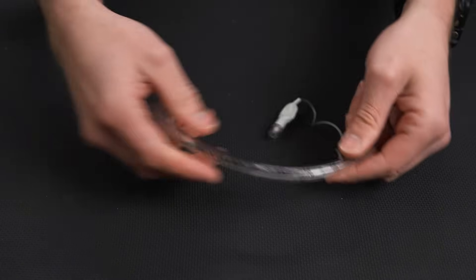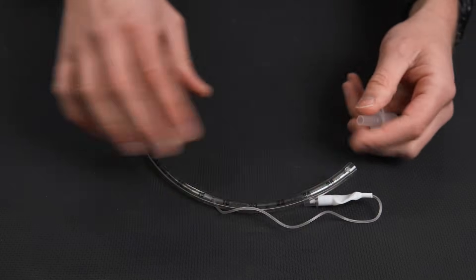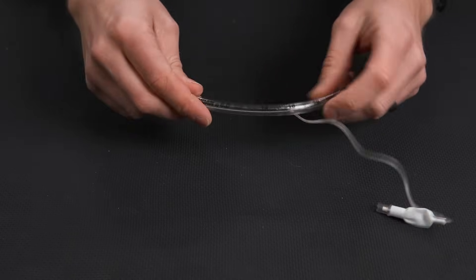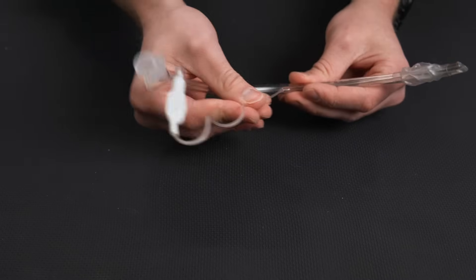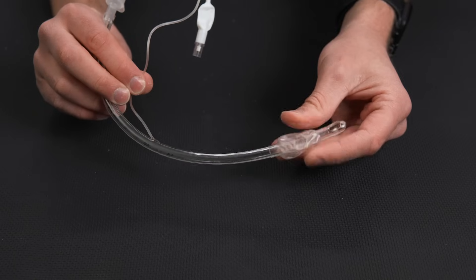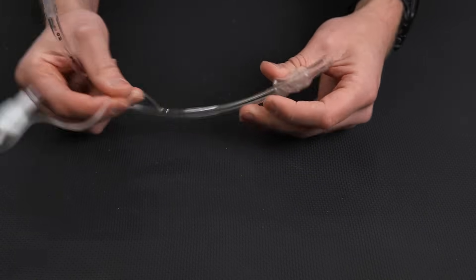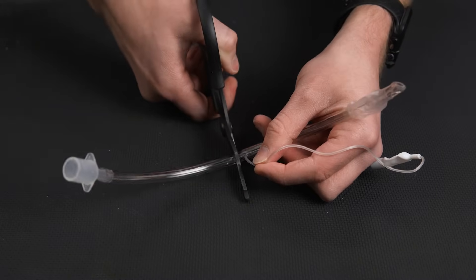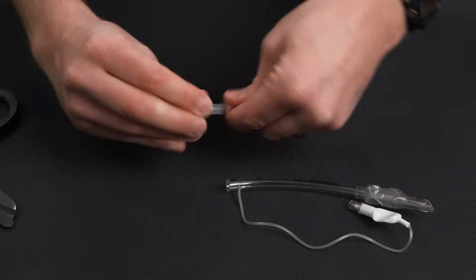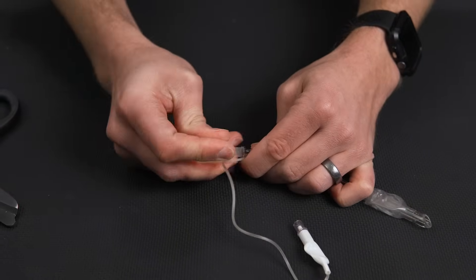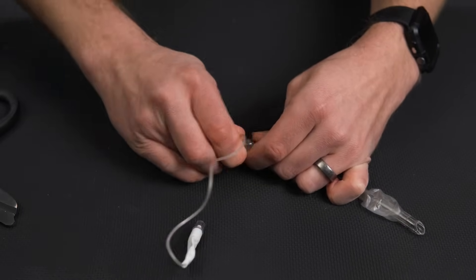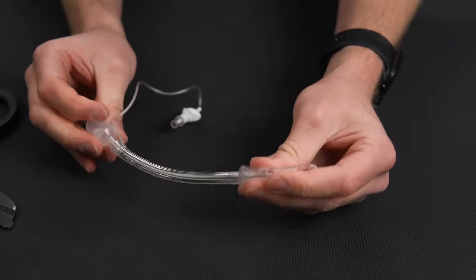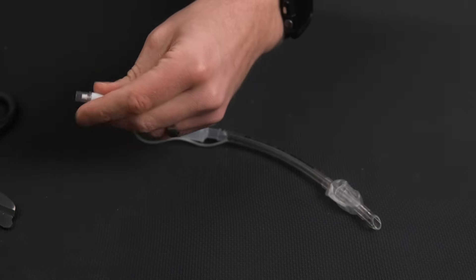The other item is if you want to cut your tube down to not have all of this hanging out in the middle of nowhere, tempting somebody to pull it out of your patient you just saved, you can cut these down. However, you have to be very specific where you cut it. You have this tube that comes out that is the inflation lumen for this guy down here that actually protects the airway and allows you to provide positive pressure. So when we're doing this, we want to make sure we cut right above it. I can take my trauma shears, I can cut right above that tube, and then I take the top of this, remove it, and we can insert it right here. This can be relatively difficult to do. So make sure you are prepped for it. And now we have a little bit of a shorter tube and this lumen will still work when we inflate it with our 10cc syringe.